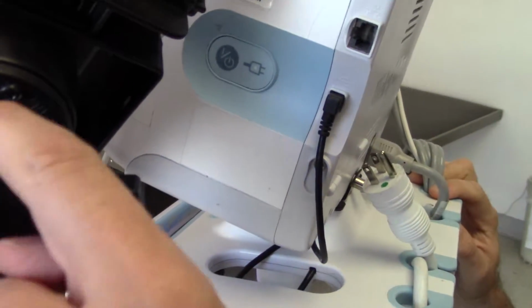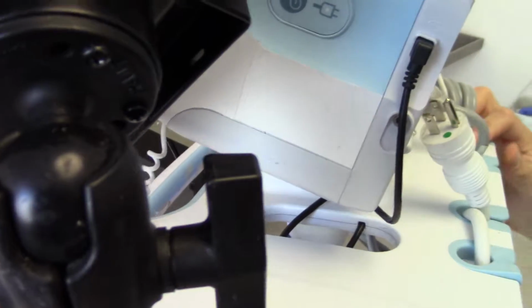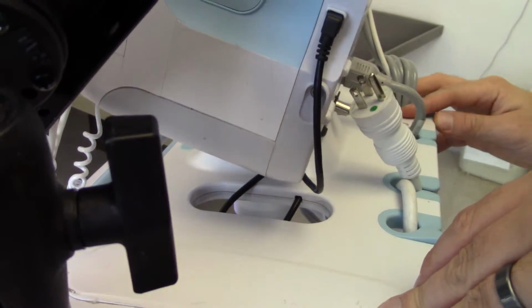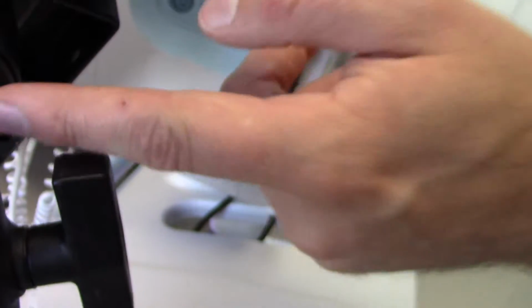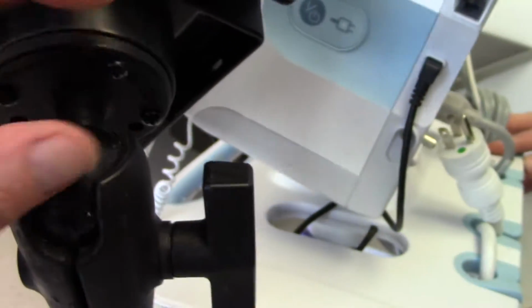And Ram mounts, they have a variety of ball sizes for different weight capacities or strength situations. Now this ball mount here, this piece feels like it's all part of the iPad frame. This piece is integrated, the pedestal is integrated, and then you have this ball mount and the little foundation here is what bolts onto the little pedestal. So somebody had to figure out how to mount this onto this?